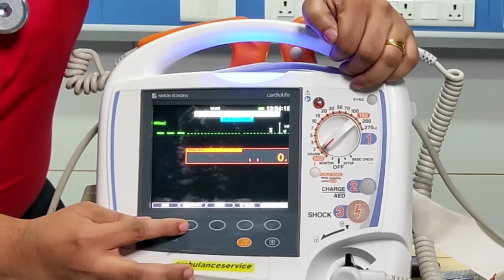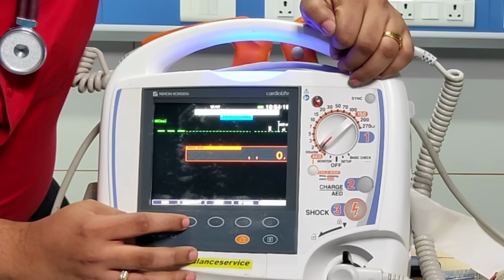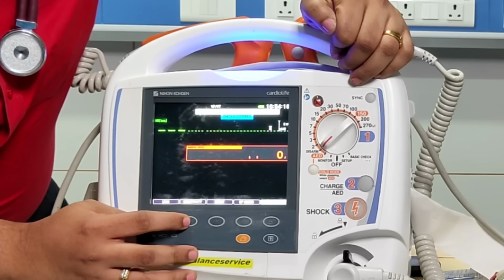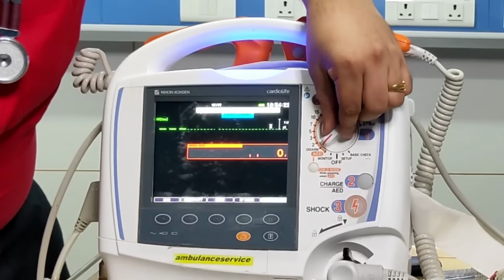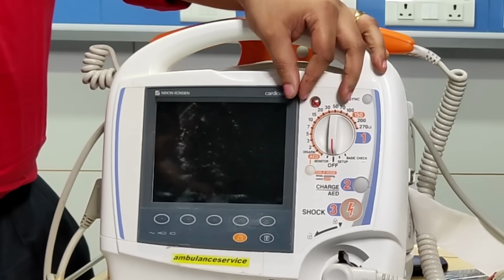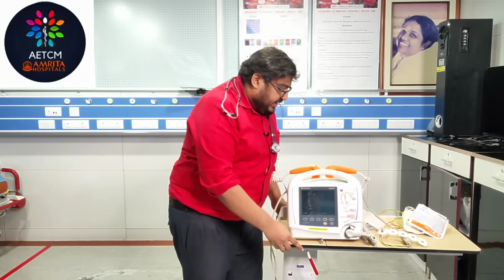And sometimes in case of fine VF, we will not be able to identify the fine VF. So we can increase the sensitivity here. So 0.2, 0.5, 2 millivolts. So it can increase as well as decrease the amplitude, and there are various other buttons which can help you in retrieving the data and all those things. So these are the basic parts of your defibrillator.